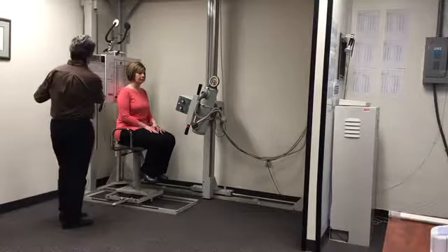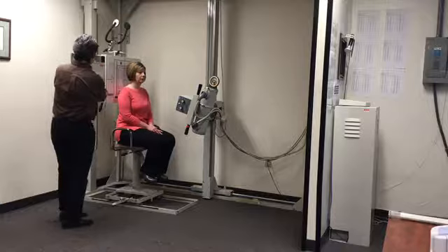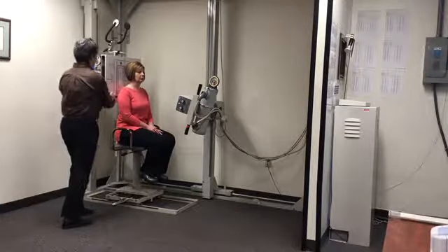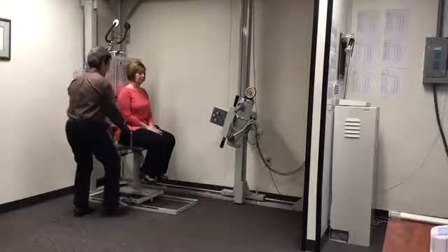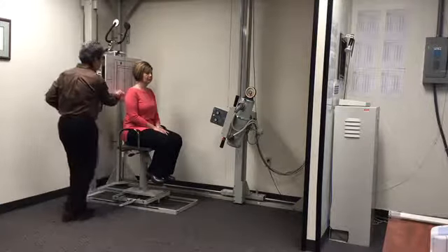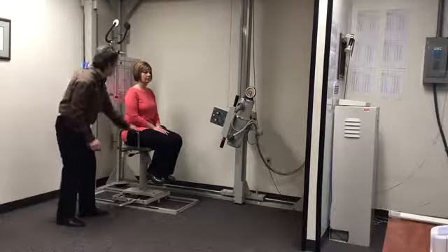Okay? We're going to change our cassette. New cassette will go in. I'm going to move this tube back out of the way. Okay, I'm going to bring you forward a little bit on the bucky. We're going to reposition the anatomical marker, or at least make sure it hasn't fallen off the bucky. We reset our exposure factors for the next image.